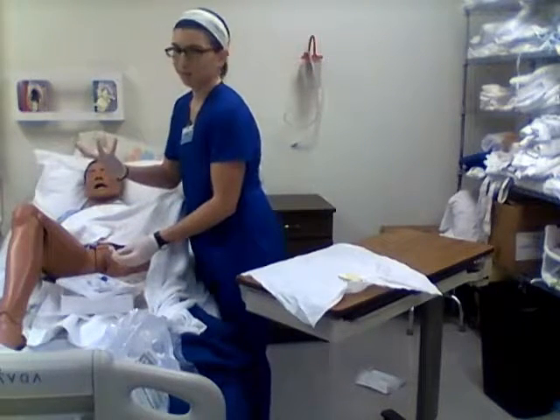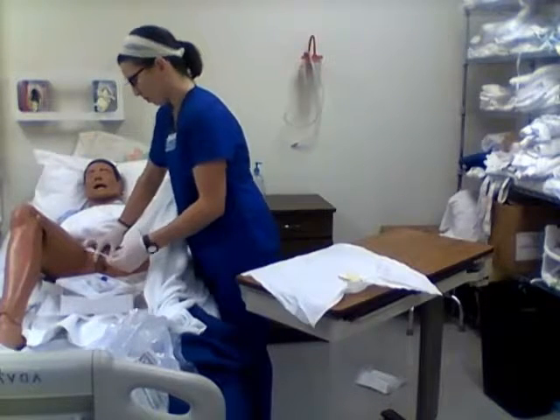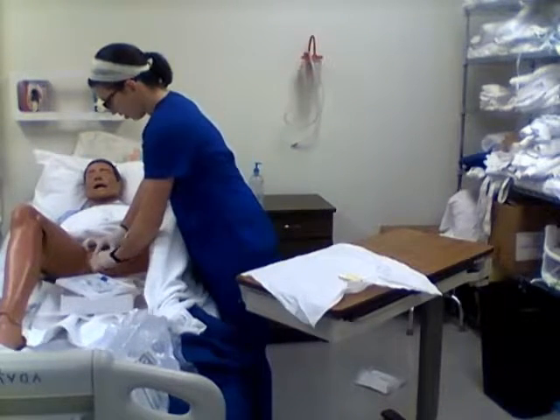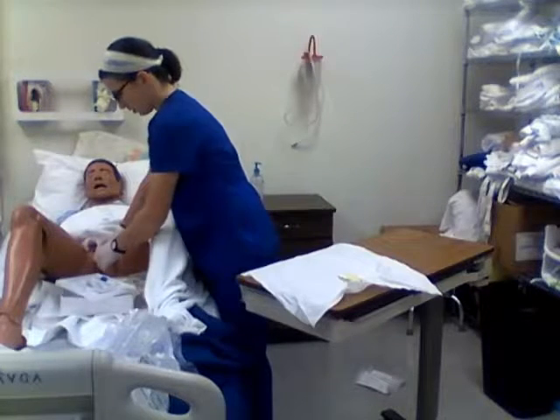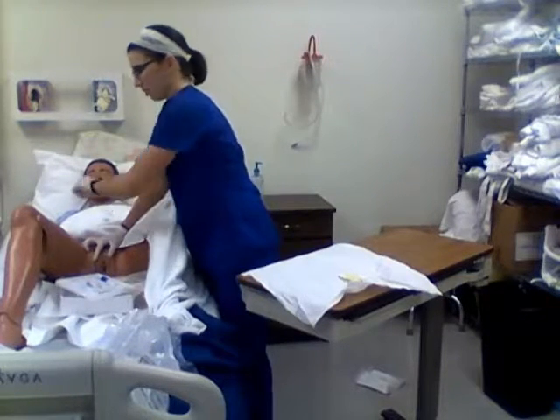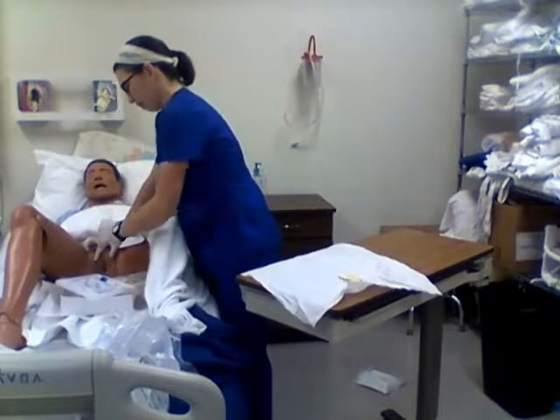All right, so I'm going to make my non-dominant hand, which is my left hand. I'm right-handed. So I'm going to spread apart her labia, and now I'm going to clean her with the antiseptic. So you're going to go outer, then throw it away. Then I'm going to go labia majora towards me, and I'm going to maintain sterility and throw it away. Same thing with labia minora.